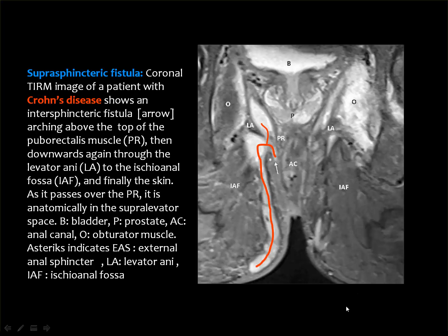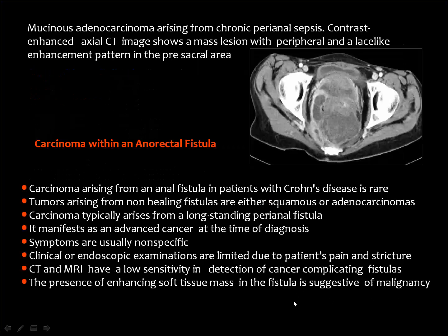Actually, you will feel some difficulties in interpreting the anal fistulae, especially in the complicated cases. But if you persist in learning such an area anatomically and pathologically, then you will have your own experience in your own reporting time for this particular disease.